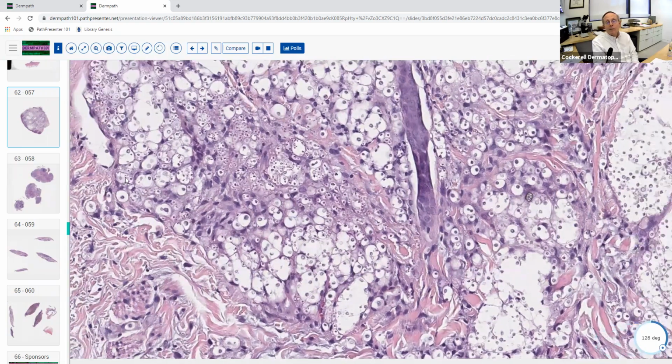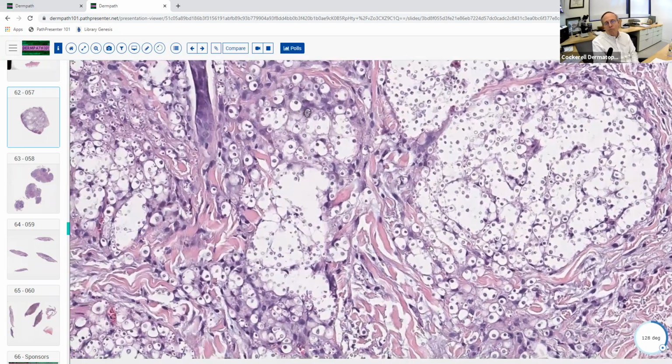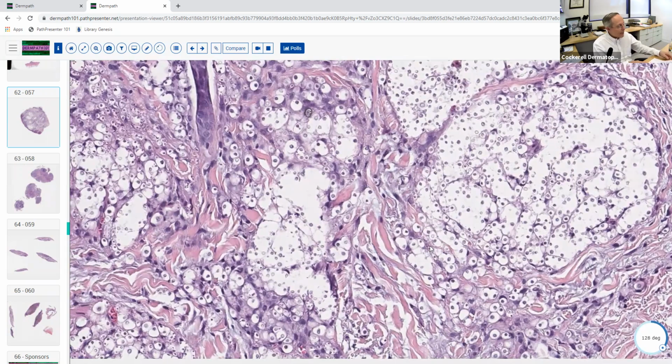So hopefully it should be very, very easy for you that you said, crypto, no problem. Easy to diagnose, not a problem at all. And so this is basically a 55-year-old HIV positive man, widespread cutaneous lesions. Best diagnosis is crypto. So we've already looked at histo. We've already looked at cocci. Blasto, broad-based budding yeast. Are these broad-based budding yeasts? I see no buds. So the answer is no, these are not. This is the massive mucogelatinous capsule that surrounds crypto, okay?